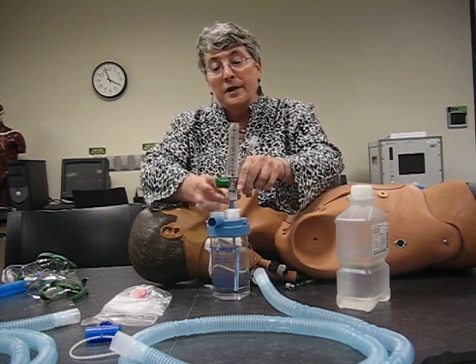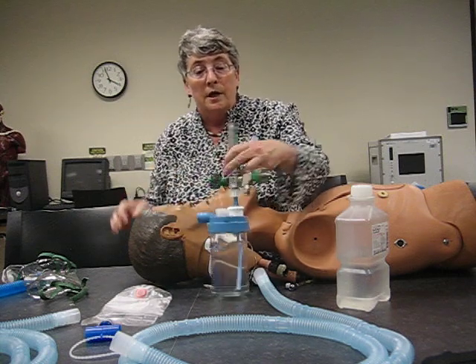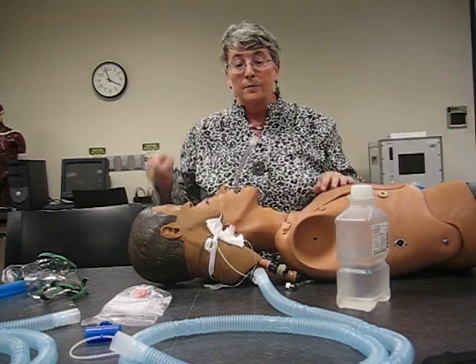Generally the flow on these things — I usually start at least 10 liters per minute. Then what you do is watch the flow running through the device, because you can see the mist while the patient breathes. You want to see the mist disappearing a little bit, but not too much.